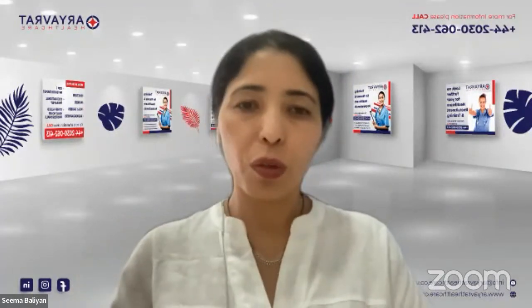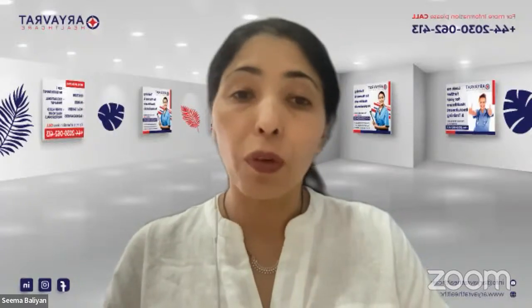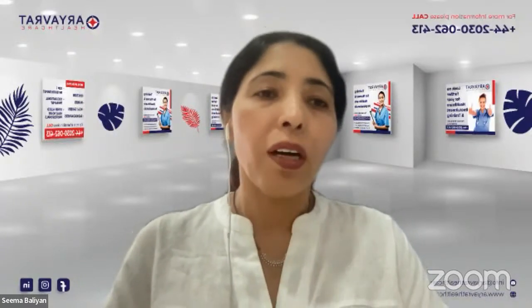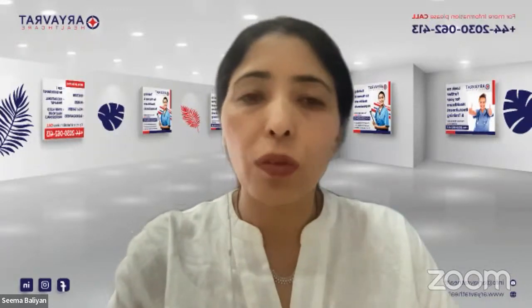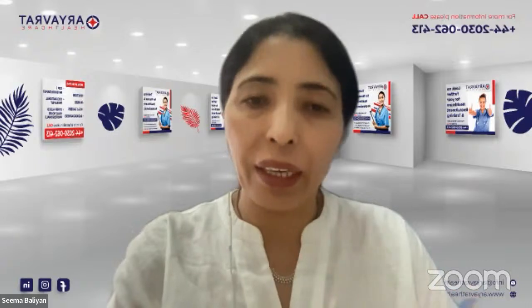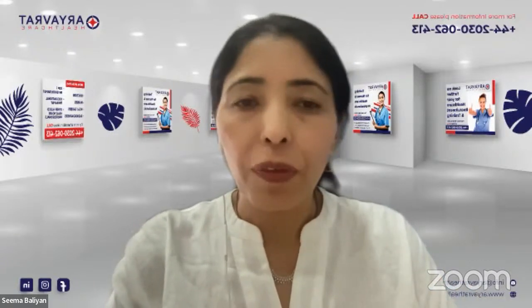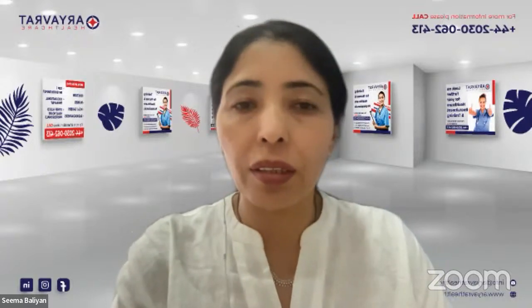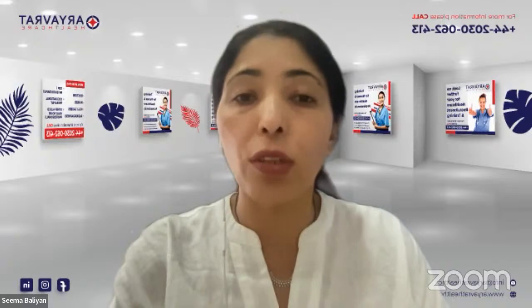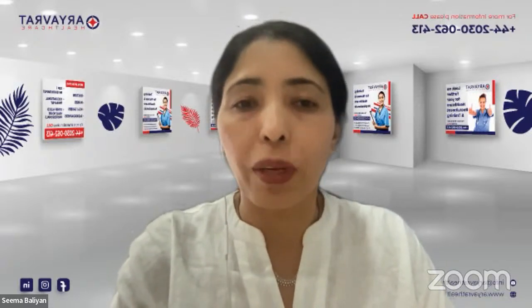Okay, so the first thing we are going to do today is the peak flow. As I said earlier, today we will be doing peak flow and inhaler and MSU. Out of these two stations, peak flow and inhaler, these are stations where you have to educate the patient and also do the procedure as well.